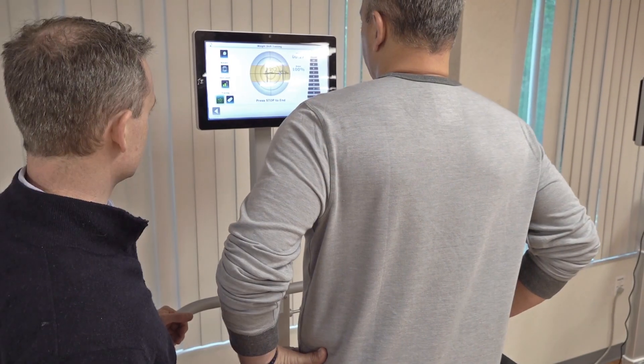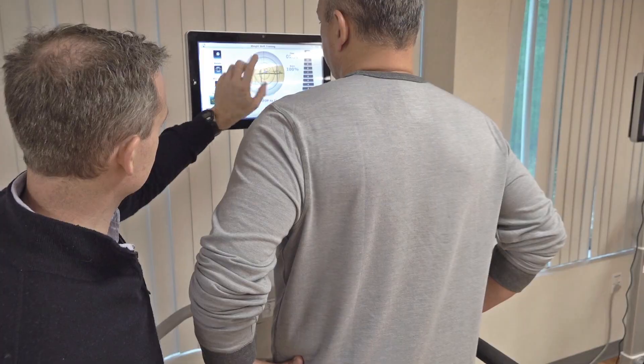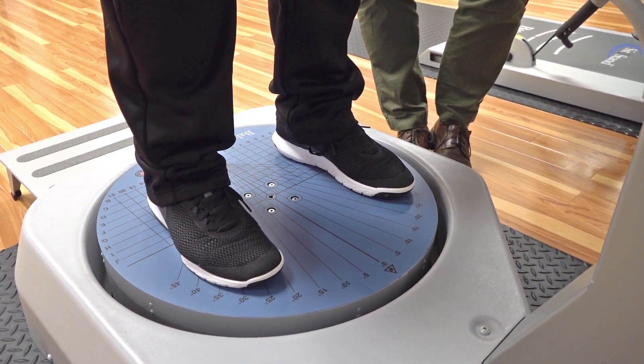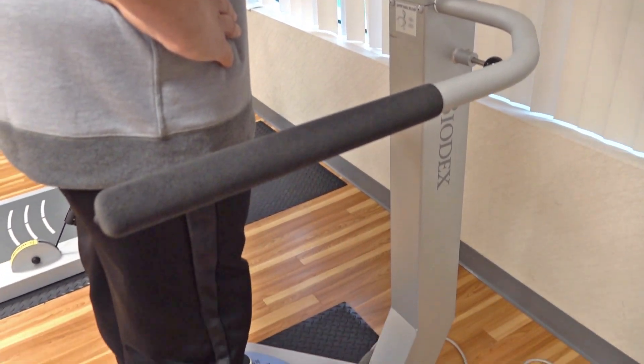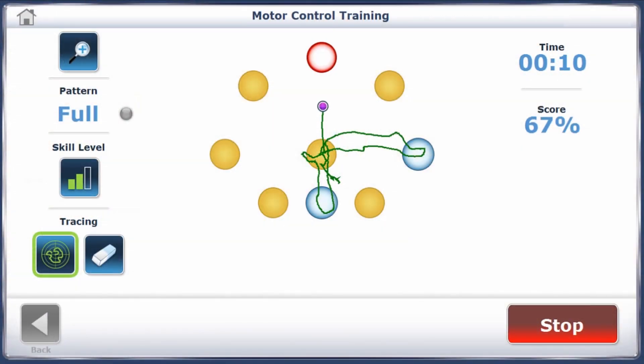Once our patient gains more freedom to move safely, we can progress them from small to large excursions, multi-plane movements, and from stable to unstable surfaces. To help regain proprioception in the involved limb, have the patient stand with eyes closed on a foam pad or by varying the direction of movement.